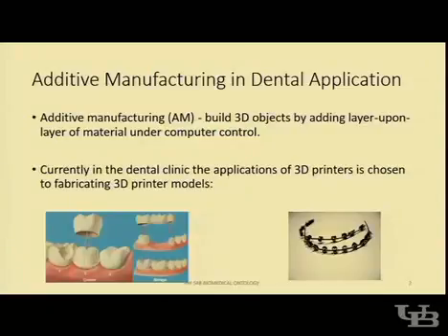Currently, these are some of the applications of 3D printers used in dental applications: the crown and bridge, braces, and also other medical appliances.